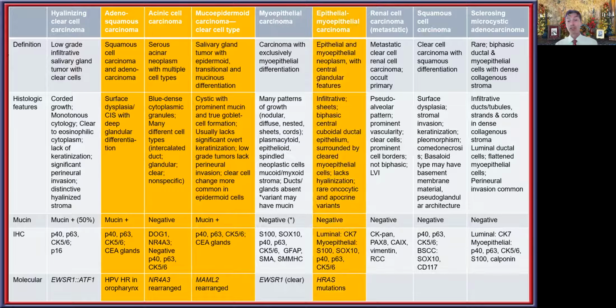So I think the glandular features of this tumor are quite well developed here, while the squamous feature is well developed immediately below. Here, it's a much more well-defined separation, where you can see that this is the area of squamous differentiation, although still the potential for gland formation can be seen, while this lower portion is much more obviously a glandular or adenocarcinoma component. Blending can be seen in hyalinization. So here you can see hyalinization, and then mucocyte presentation is seen here as well.